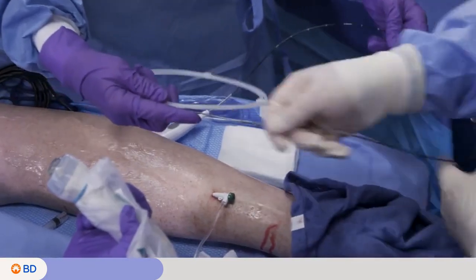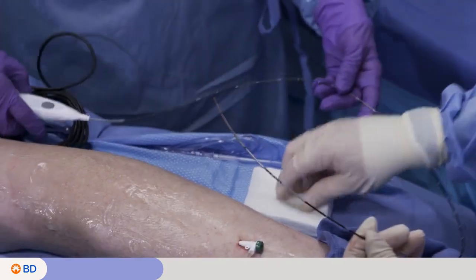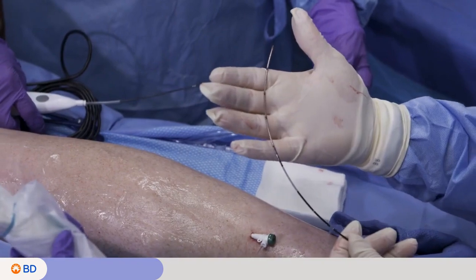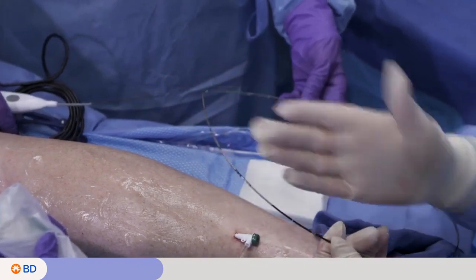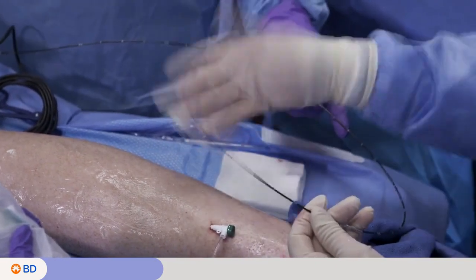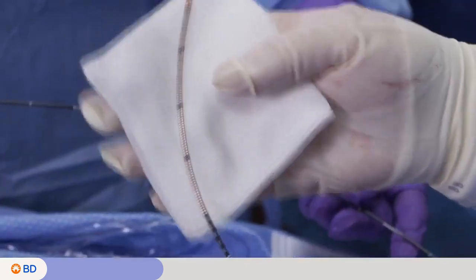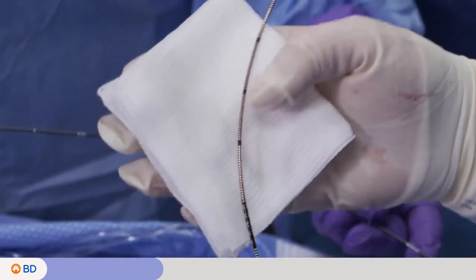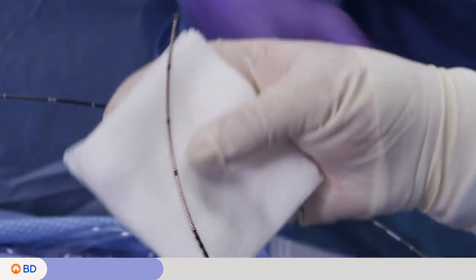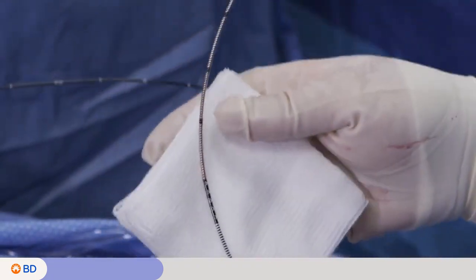And she hands off the device to me, and you can see the catheter is a 6-French catheter that has a natural curve, which is very helpful as you negotiate through anatomy. You don't typically have to shape this at all. And of course, we have a 10 centimeter heating element and coil, and 3 divisions that mark off 2.5 centimeters, which we'll get to about converting this to the distal tip function.